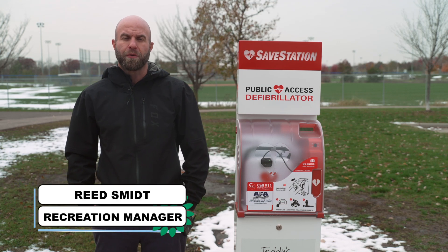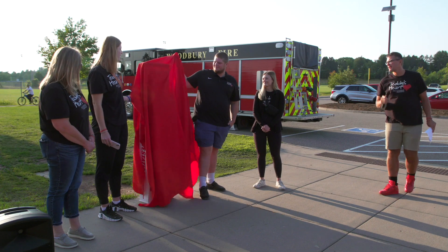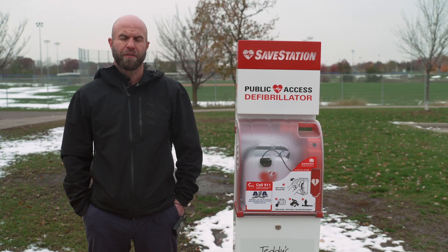I'm Reid Smit, Recreation Manager for the City of Woodbury. I'm standing next to a save station that includes an AED unit. These units were donated by the Teddy's Heart Foundation, and the City of Woodbury is installing these units at strategic locations throughout the community in case of an emergency.